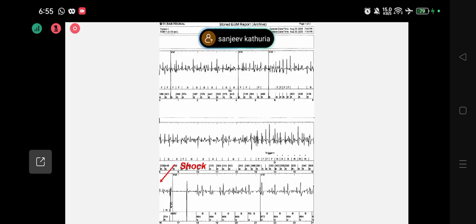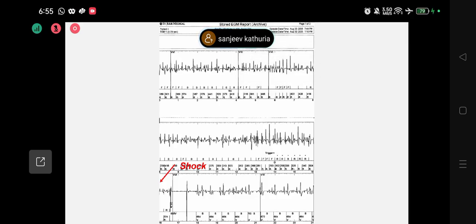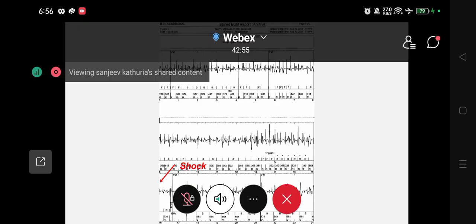And very good. I'll tell you a lot of examples because Dr. Vimal has told me to focus on examples. By the end of this, you will exactly know how to interpret it. So now see, once it reached a particular level, the capacitor is charged. After a few seconds only, in this case maybe 5-6 seconds, it has given a shock. Let's see what has happened. The shock has stabilized the machine. And again, within a matter of 1 second, it restarts because this is not a VT. The capacitor is firing in the air. It will never be able to do anything.